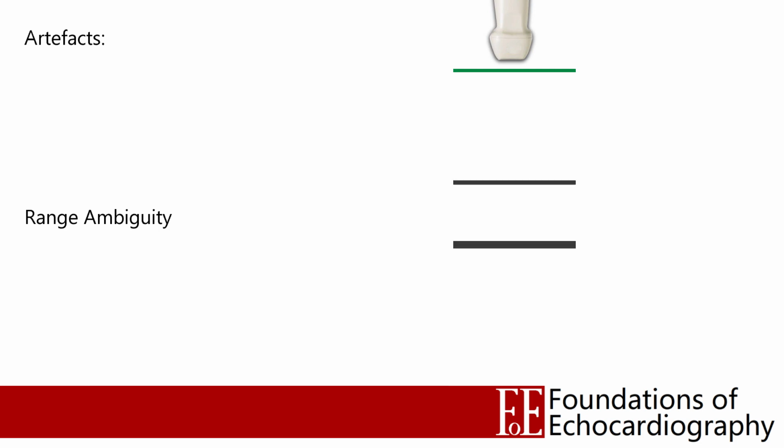So let's imagine that we're imaging our patient and these two grey structures here represent reflective surfaces within the patient. The first is 10 cm from a probe, and the second is 12 cm from a probe. So we start firing our ultrasound waves into the patient, and the first wave that reflects off the first line travels 10 cm into the patient, 10 cm back to the probe, and has travelled a total of 20 cm. So when the ultrasound software displays this on our screen as a structure, it estimates that this structure must be 10 cm away from us.